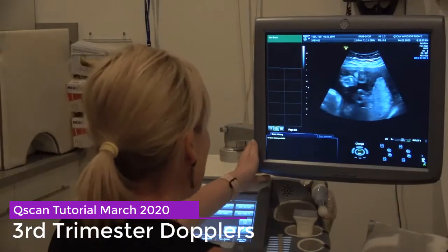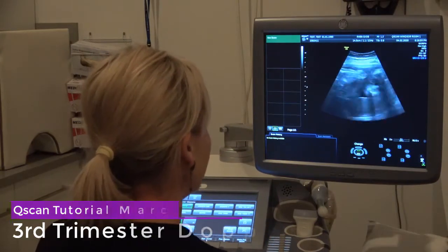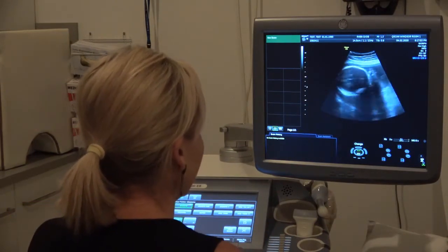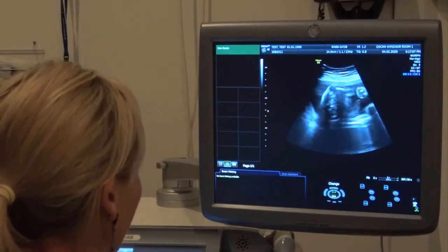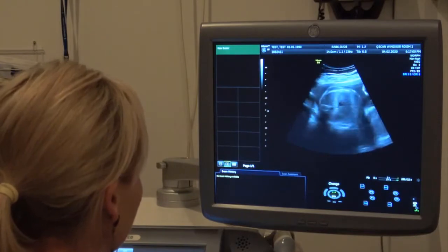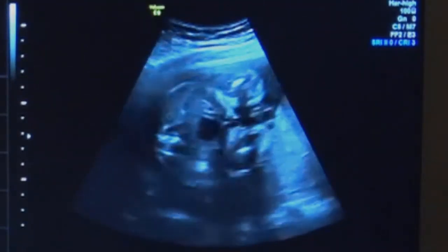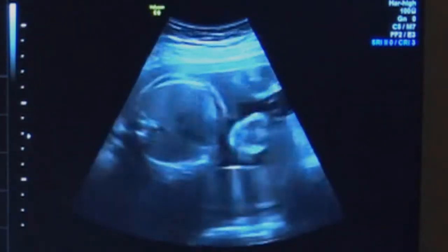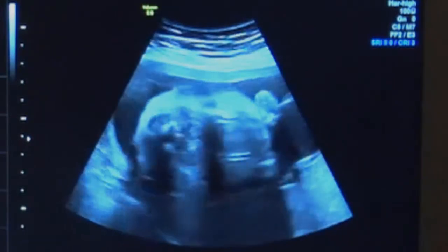Well, you've all scanned babies. You've all done growths, yeah? Okay. So I guess it goes without saying, you find the head, and if you haven't seen the baby before, you check the situs. If we haven't seen the patient at all, we do everything. Head looks beautiful. So head up, lying breech at the moment.